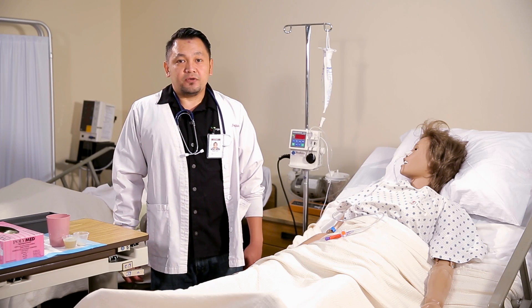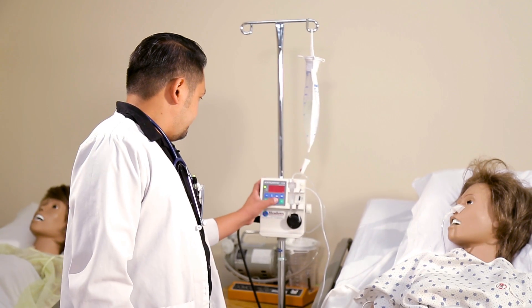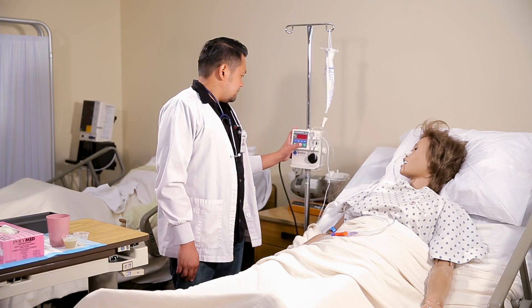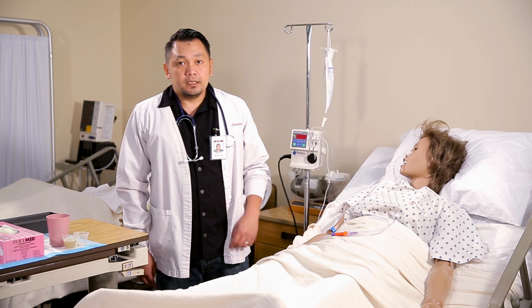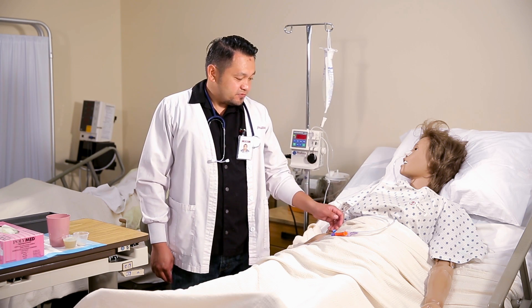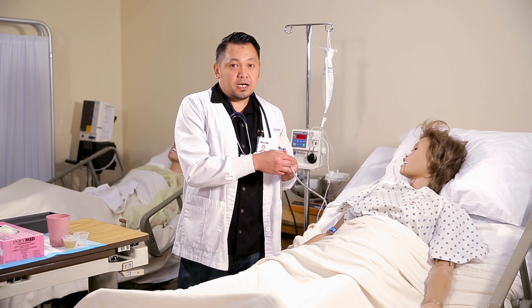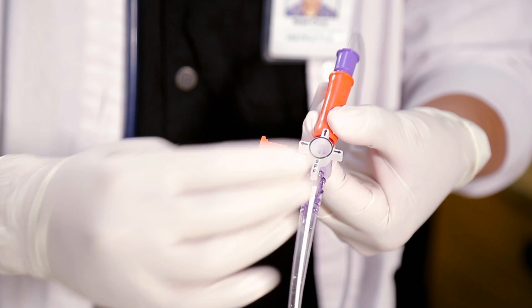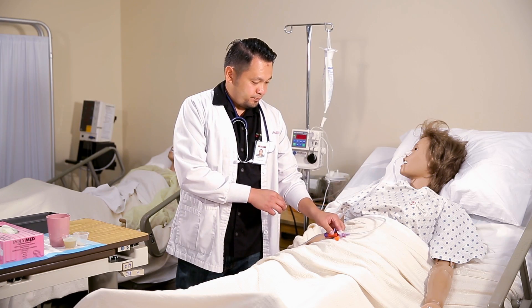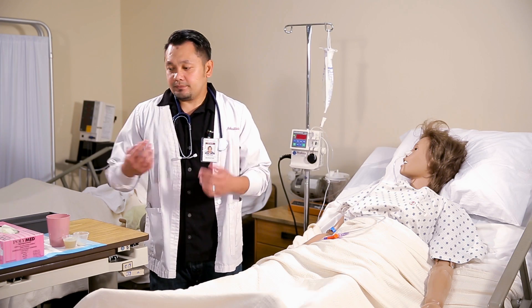Then we must stop our feeding pump. Then we need to access our Lopez valve. Turn the knob to stop the flow. And put on our clean gloves.